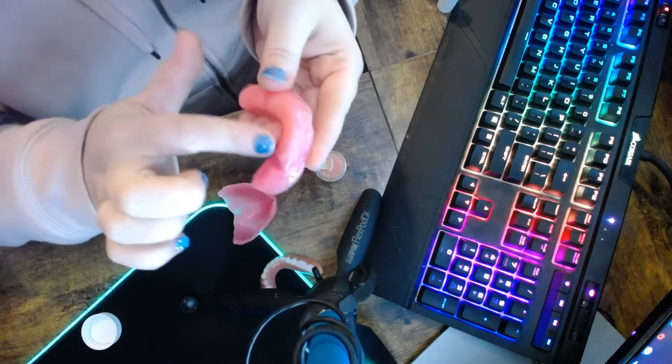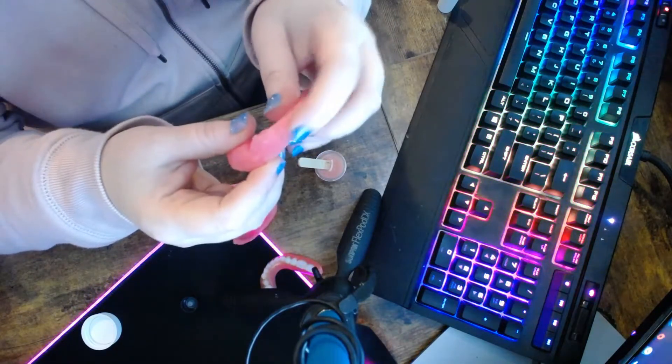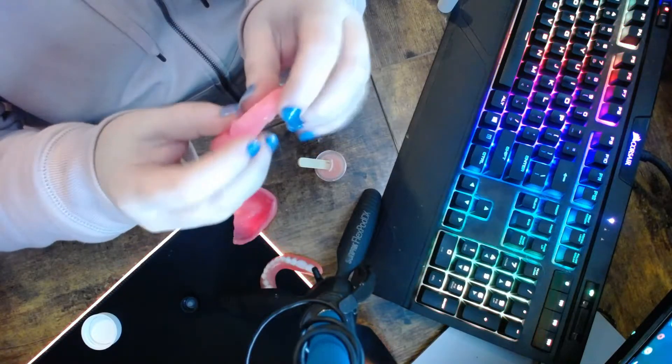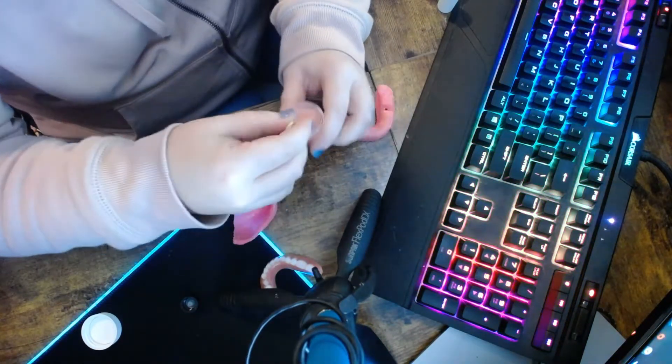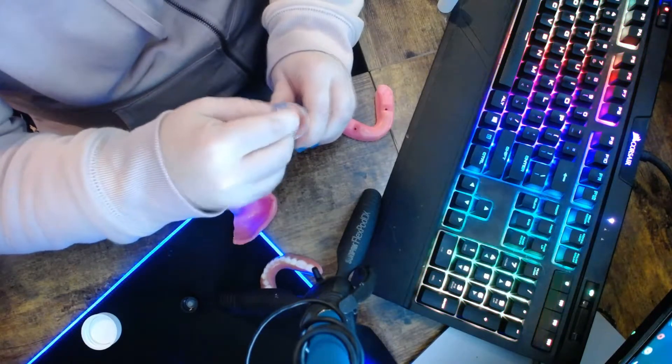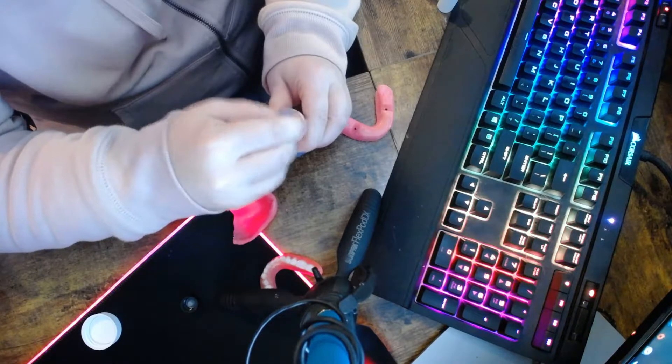Now, if this had been too tall, I could have shaved some off the top of it. Since it was too far forward, I did cut some off the front right here. It's still a little too much for me — and my ProSoft's starting to set up.